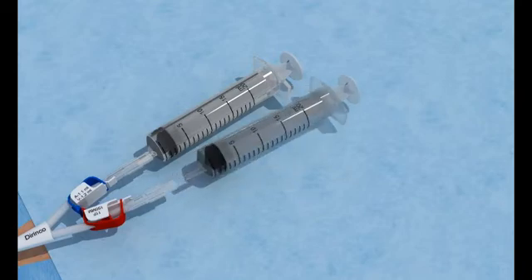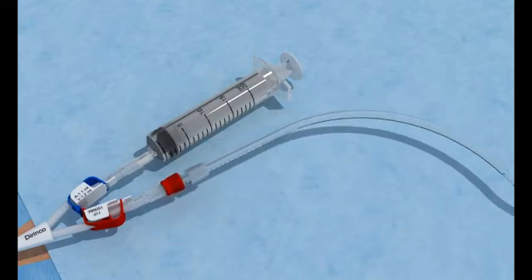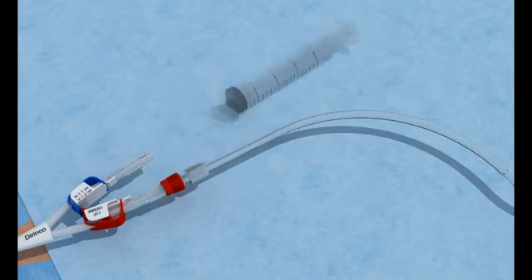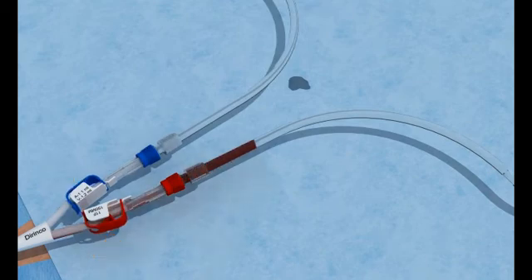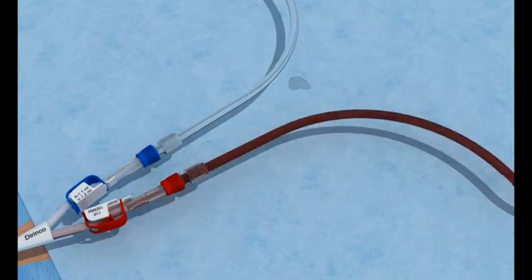Connect the bloodlines. Connect the arterial bloodline to the arterial lumen and remove the empty 20ml syringe. Connect the venous line. Open the clamps and start the dialysis. Restore the patient to an upright position.